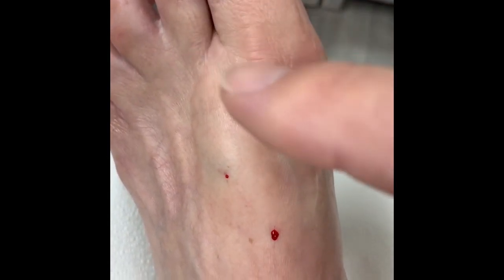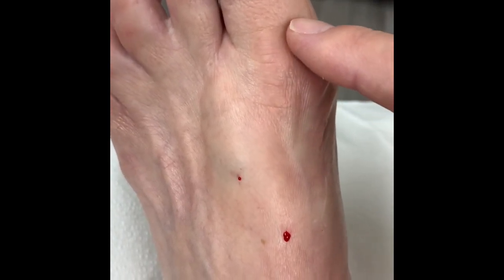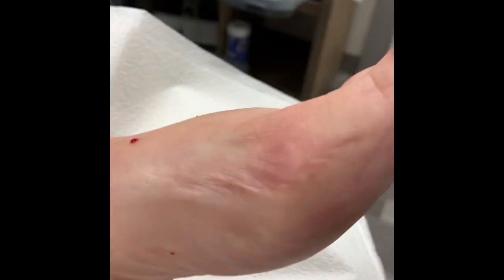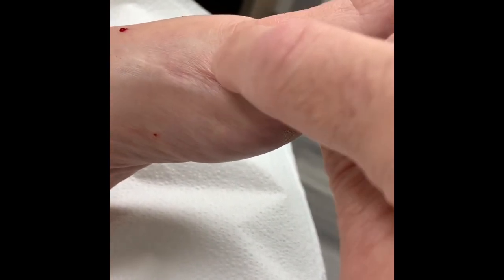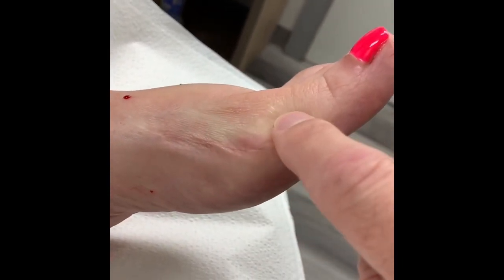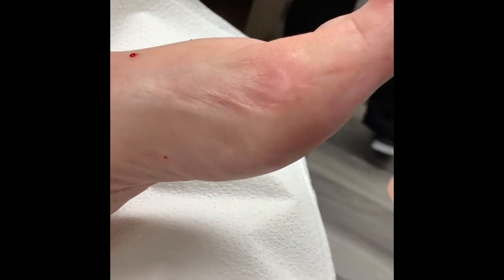All of this is arthritis — this is not anesthesia, what you guys see here is anesthesia. Now I'm going to give you guys a side view. All of this is arthritis, all of it. And as everyone can see, it's hard because the anesthesia is already here, but all of this is bone spur.